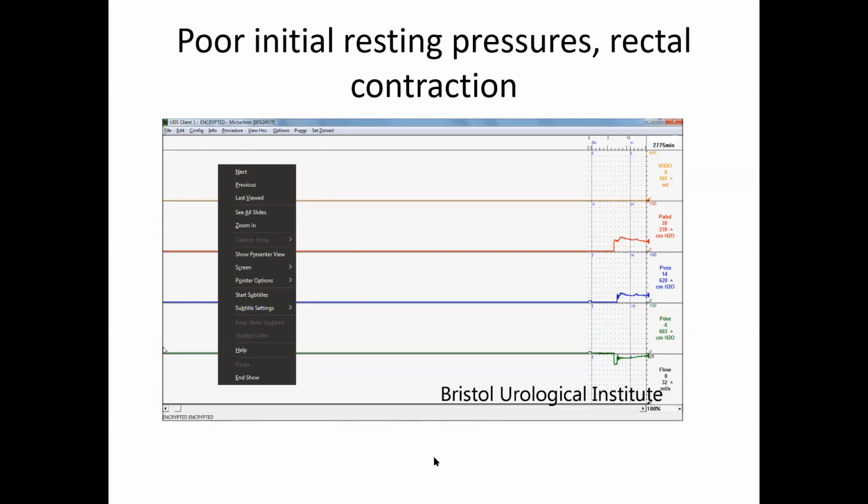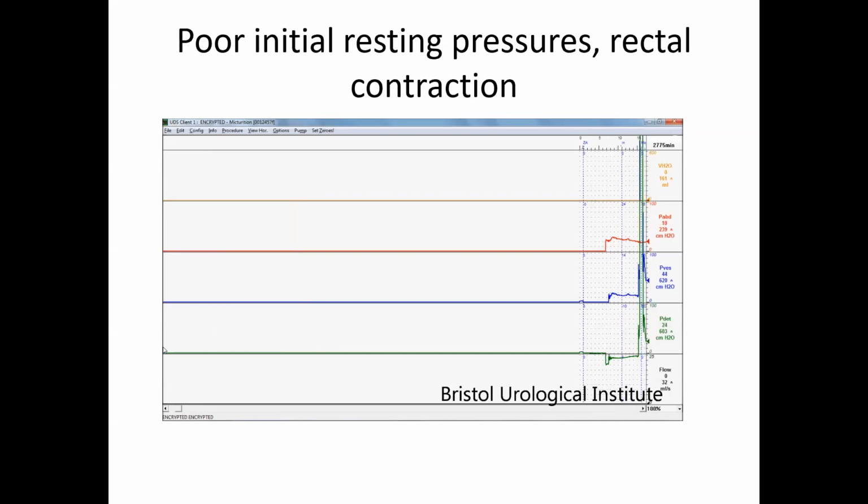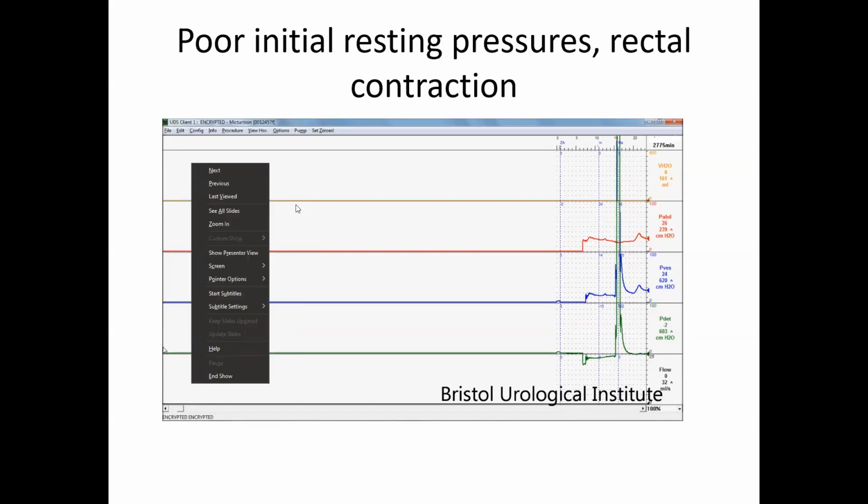So that is the process of troubleshooting. It's actually really simple. You've identified that there's an issue. You've worked out what you're going to do about it. You're going to flush it. And then you're going to check afterwards that that has actually worked. So there's your flush on the vesicle line. Then there's some form of increase in abdominal pressure, which would give you an increase on both the abdominal and the vesicle line. So if your patient can't cough, it might be a blow on the back of their hand or something that will increase the pressure in both, that lets you know that it's working fully.